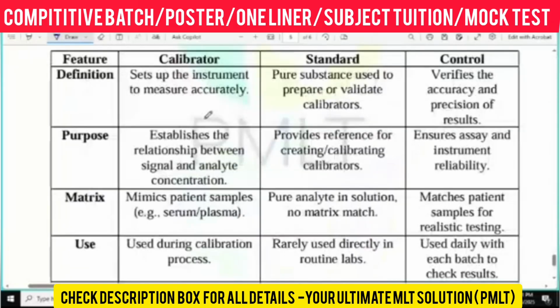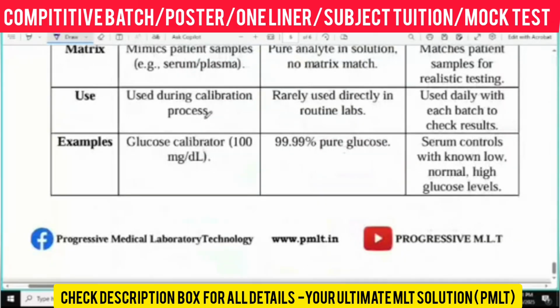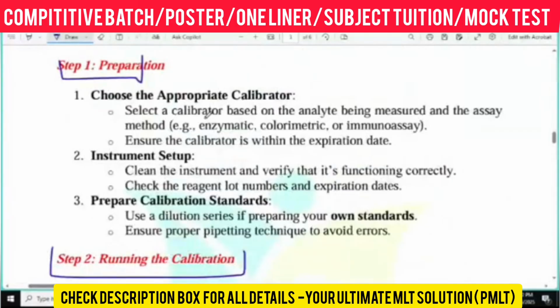See, now I am discussing how it's happening. Firstly, preparation: choose the appropriate calibrator. That depends upon which kind of reaction is happening. The reaction might be enzymatic, colorimetric, semi-auto, automatic, or immunoassay. So you have to choose the calibrator based upon the reaction.